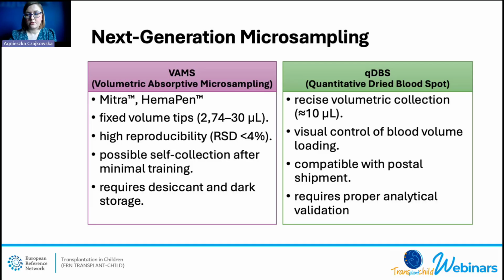These techniques allow the collection of a fixed, very small blood volume every time. Special devices ensure excellent reproducibility, with coefficients of variation below a few percent.